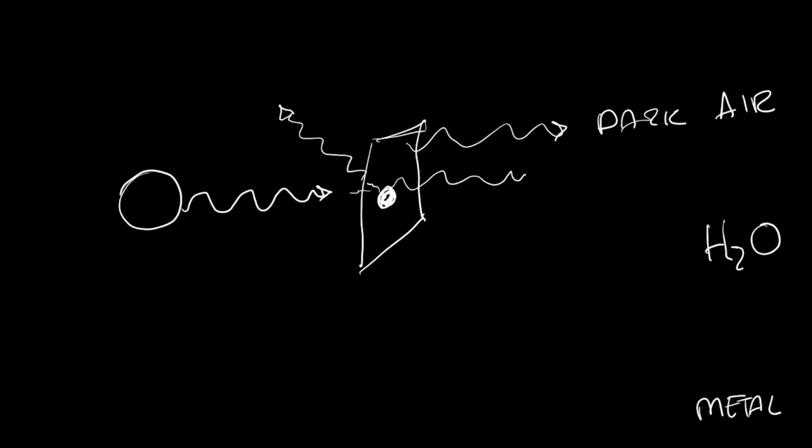One of those structures is typically minerals. The one that we're going to talk about today is calcium, right? And things that were less dense than water, but not as hypodense or less dense as air, which was going to be fat.